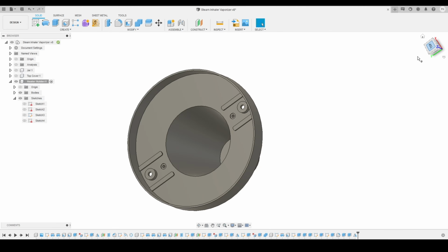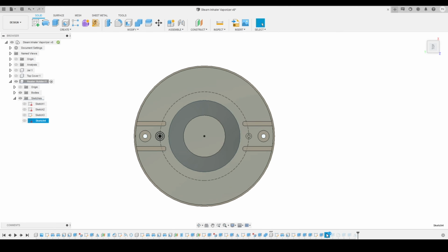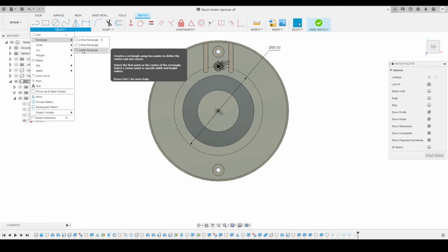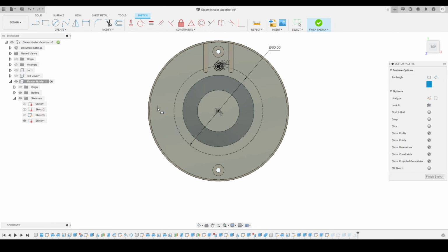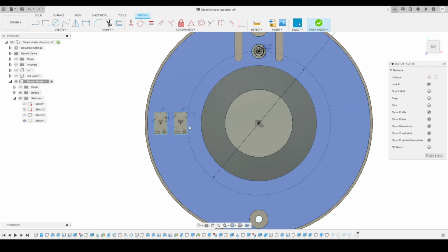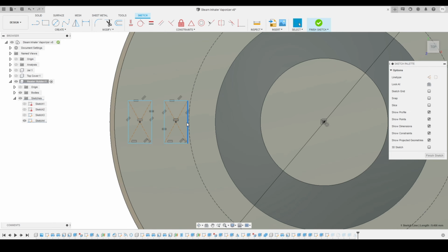Now we'll go on to the top view and go back to edit the sketch that we had created for this circle. Now we'll activate our rectangle tool, and here we are going to add a rectangle type as center rectangle, and we'll create 2 rectangles like this. Here you can see that we have created 2 rectangles, and now we'll apply equal constraints on both the rectangles, and we'll make sure that all 3 centers are on the same horizontal position, so that we had applied the constraint.